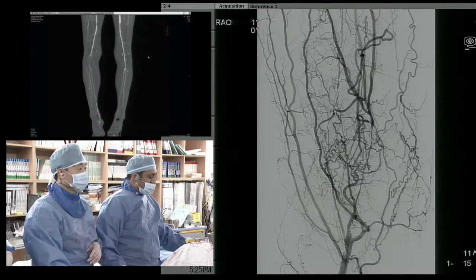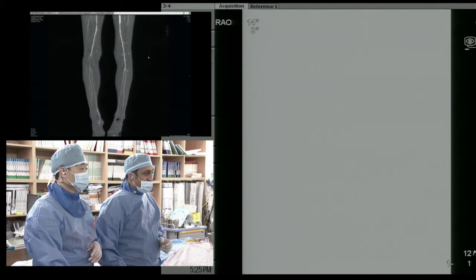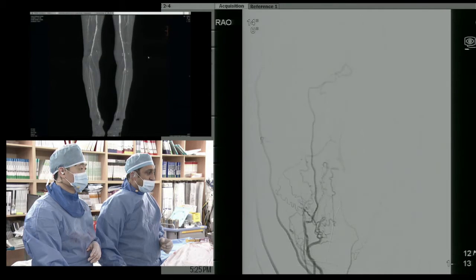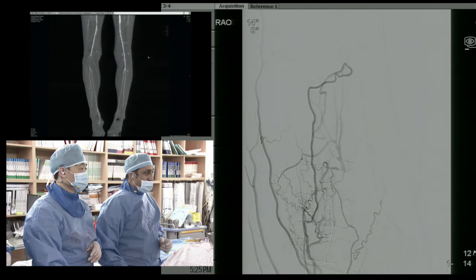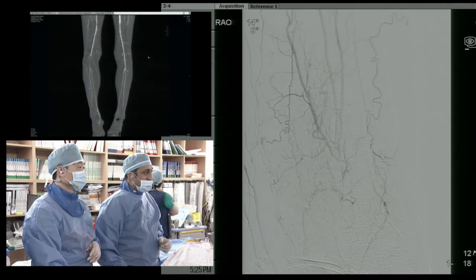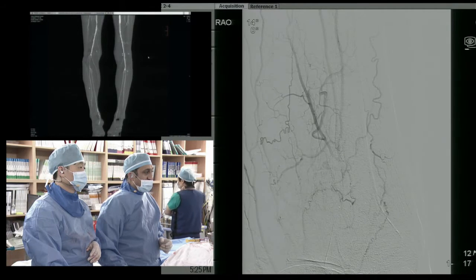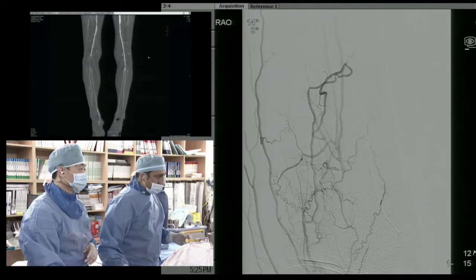We have a CXI 018 catheter for support, and we have tried so far a Glidewire M, that's an 018 Terumo wire, and we now are in with a Terumo Runthrough, but we may have to go to a CTO wire, and that's kind of where we are right now. So that's our final image, and you can see the reconstitution right there. And it is a total occlusion with microchannels about two-thirds of the way through the occlusion.